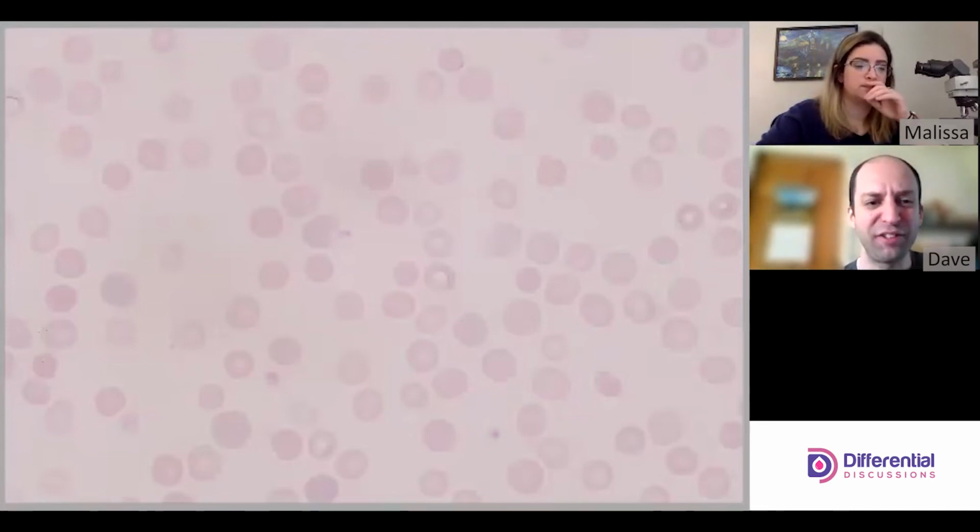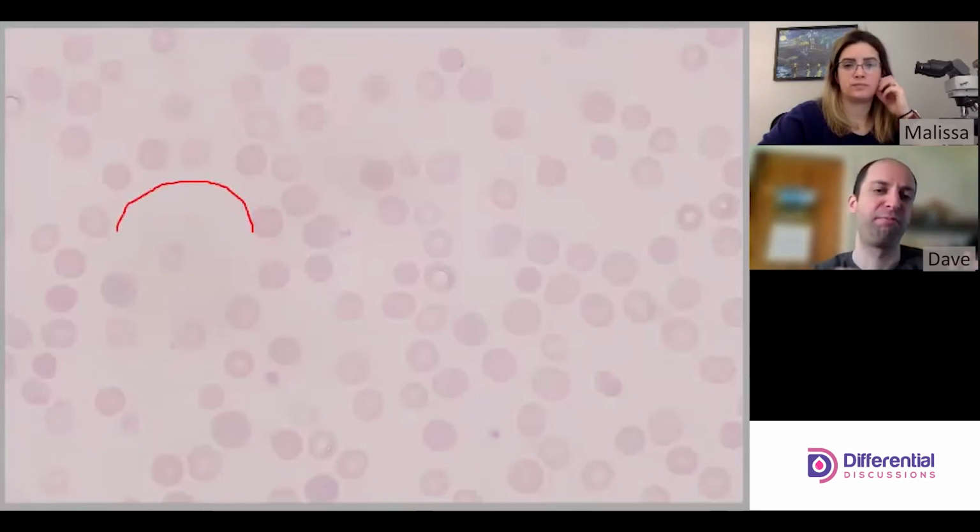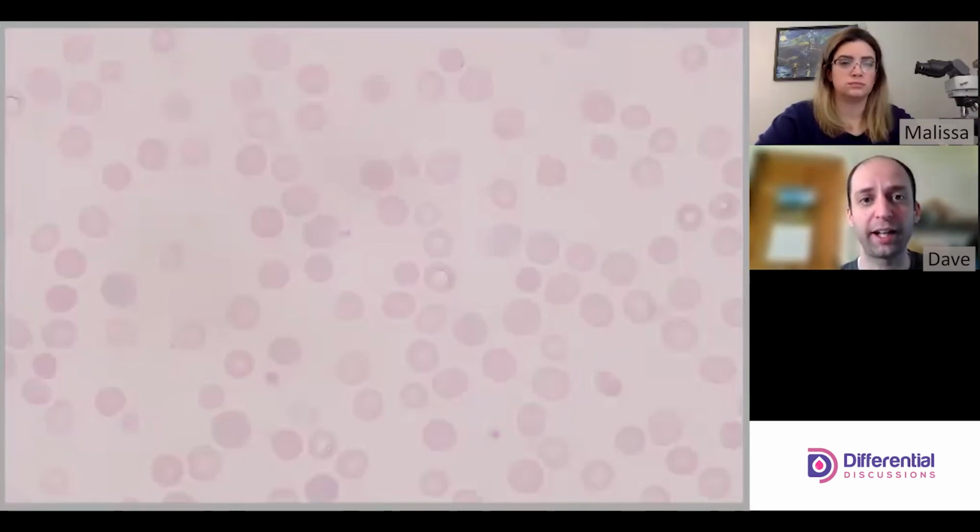Yeah. Part of the skill is detecting when you're in a poor area, and we can give you tips about that. One of the things that sticks out to me in this field in particular is the orientation of these red cells right here. That to me looks completely unnatural and not a random distribution of how the cells would be. They're being forced, so when you see patterns like this, go thicker. And also always start on 10x, 20x, whatever your scope's equipped with. I can't stress that enough for finding a good area.